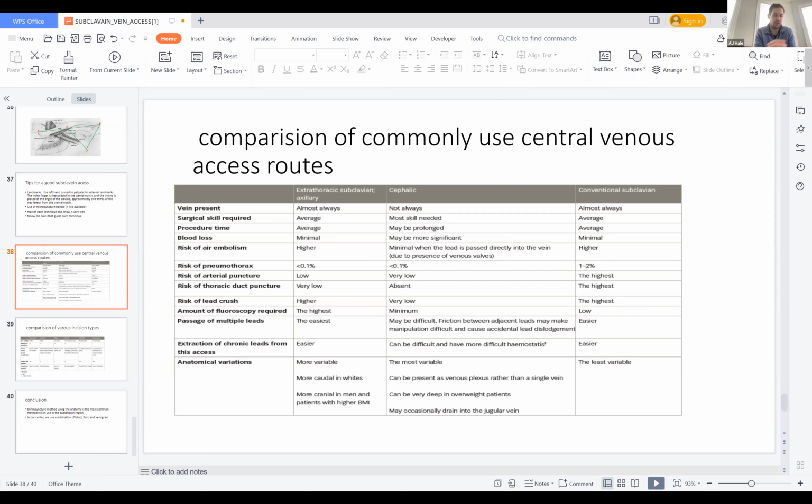And then sometimes, I don't know if you hit on this, but people will do cephalic cut downs, or even an axillary cut down to the vein itself. Those are lower risk, or no risk as far as pneumothorax, but obviously it's a little more in depth, and you have to put little purse strings to cut off the blood flow to those veins so they don't bleed out while you're working on it. You are right. No, I think that's great.